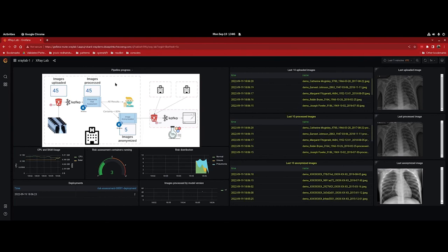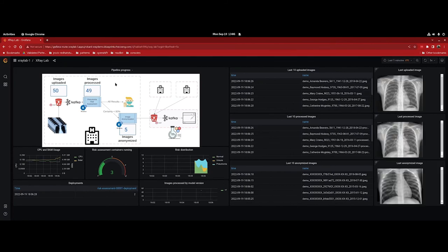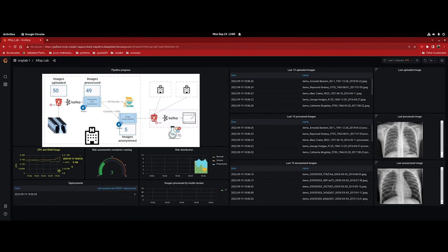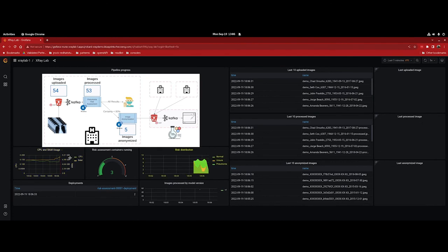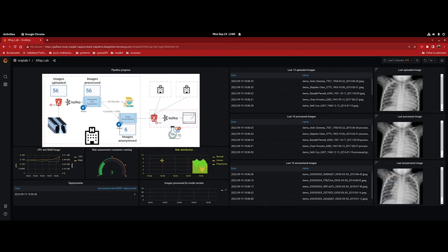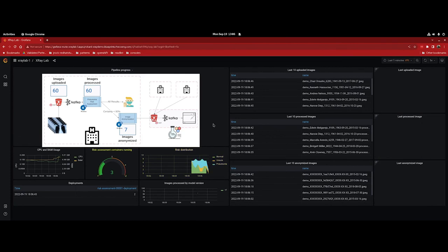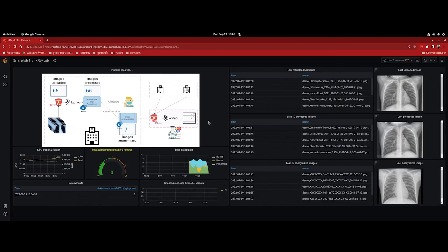So what they're doing is they're being populated into the Ceph object store bucket. That's notifying the Kafka topic. The eventing listener that's listening to that topic triggers the K-native serving function, which scales the risk assessment application up. Now the risk assessment application is a containerized machine learning model trained to make a determination as to whether the person in that image may or may not have pneumonia. Once the image has been uploaded, the dashboard is updated with a timestamp, the file name, as well as the associated image. As the images are processed through the model, the same information is output to the center table. Once the images have been processed, they go through an anonymizer to redact any personal information of the patient. We're also collecting cluster metrics for CPU and RAM from the application, as well as providing a real-time widget that shows the risk distribution of the images processed.